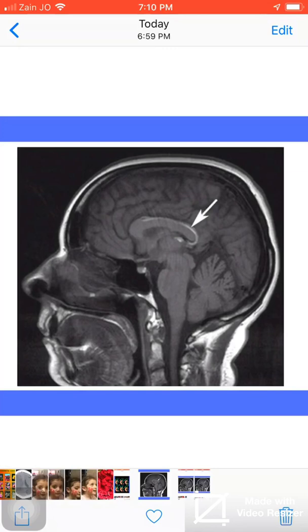This shadow runs around the corpus callosum and is in keeping with lipoma of the corpus callosum. As you see here, the lipoma's fat signal intensity is the same as the fat of the subcutaneous tissue under the skin.